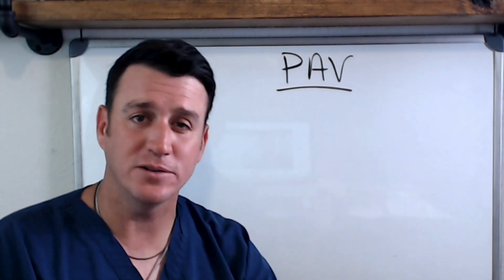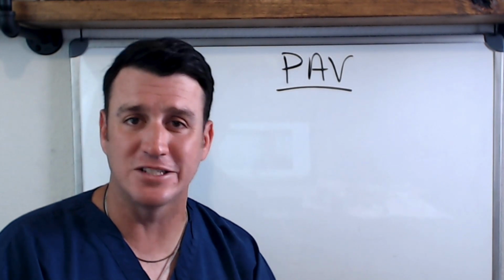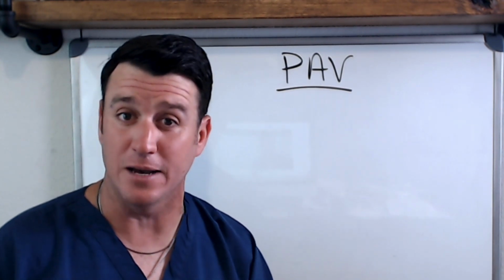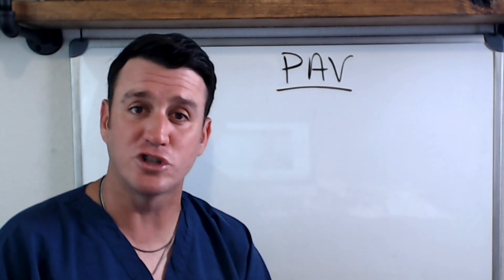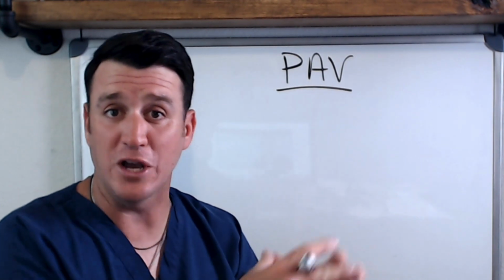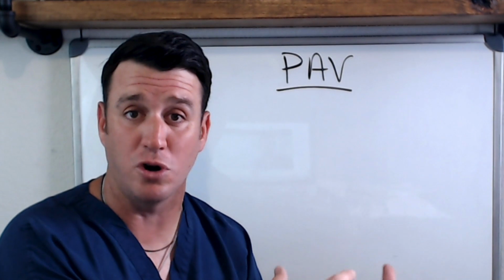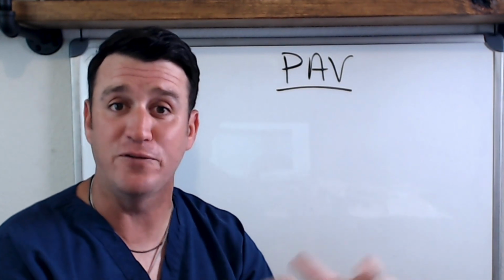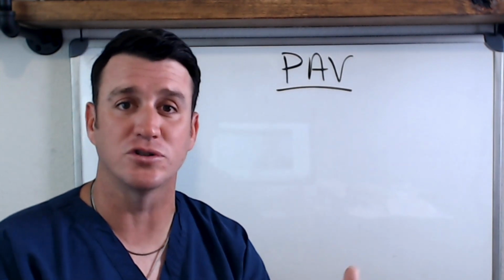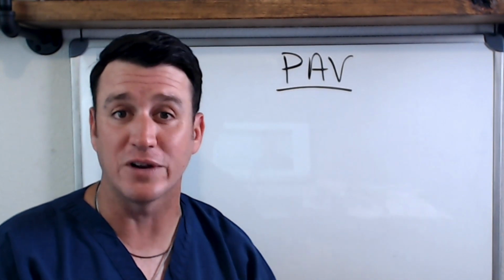Okay, so here's the problem with PAV. A lot of respiratory therapists don't like it because they simply don't understand it. It doesn't make sense to them, and that's because we are so used to our traditional methods of mechanical ventilation. We go from assist control, maybe SIMV, maybe you're in pressure control, and then we wean down and we finish the mechanical ventilation process in CPAP with pressure support. Okay, and all of those settings and all of those modes make perfect sense to us.